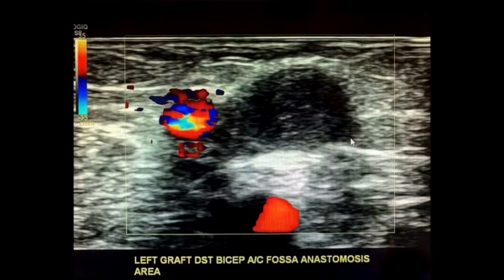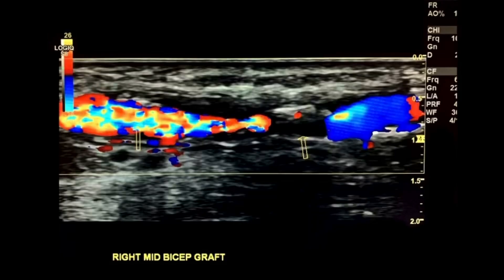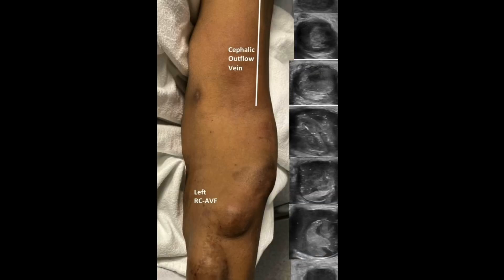Overall, you're going to want to assess for pseudoaneurysm, stenosis, thrombosis, occlusion, surgical collections, and steal. At each level, you're going to want to take transverse and sagittal grayscale images, images with color Doppler, and images with color Doppler and pulse wave Doppler.